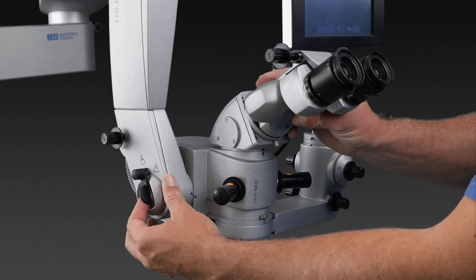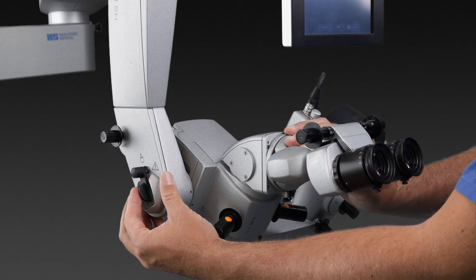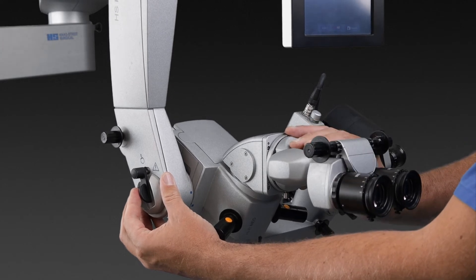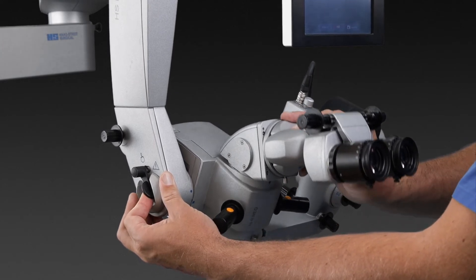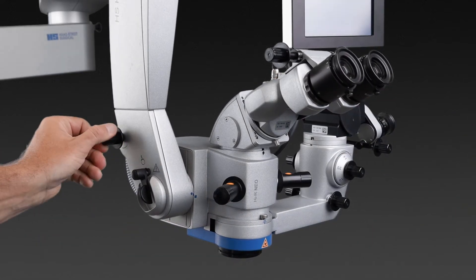To maximize the freedom of positioning the microscope, an inclination mechanism has been integrated, ranging from minus 70 degrees to plus 90 degrees. Fine adjustments can be made in a sterile manner during surgery.